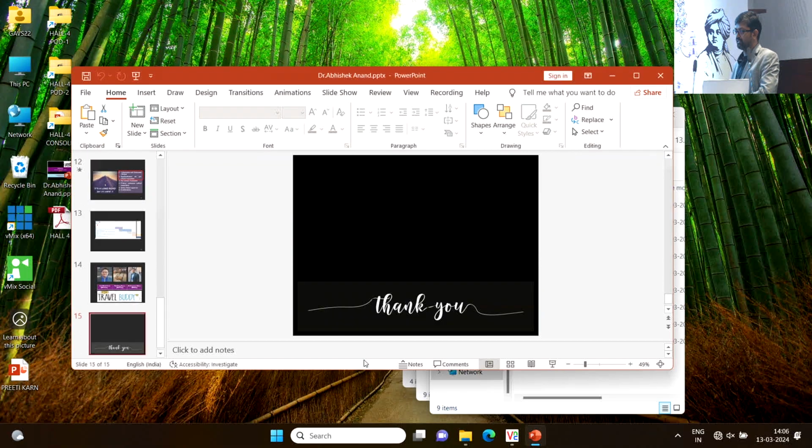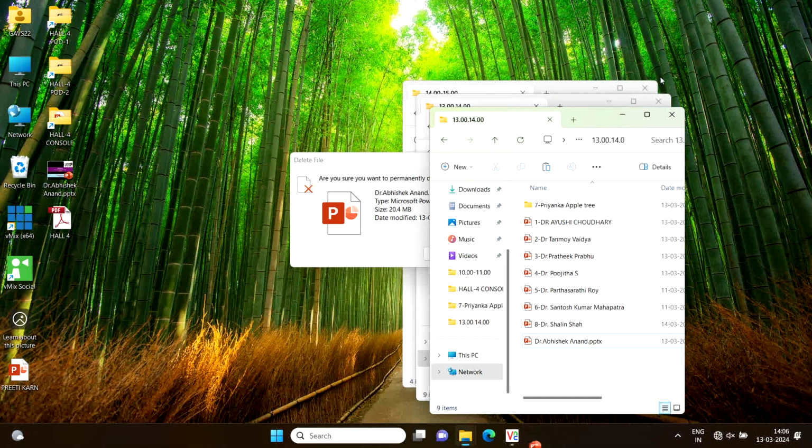Thank you. Why multi-level cutting? Multi-level cutting is needed because when we go for a finer gauge, the vitreous sometimes clogs it. It decreases the cutting, and it sometimes inhibits the aspiration. So the point is a faster removal, and we are getting this in a rotatory cutter. It also acts as a support in the middle of the shaft. So these are the two parts of the benefit.